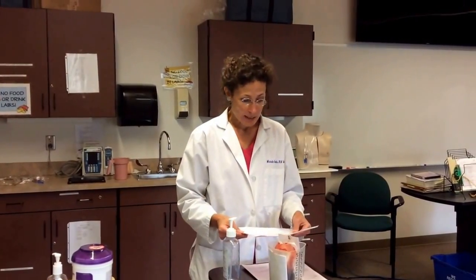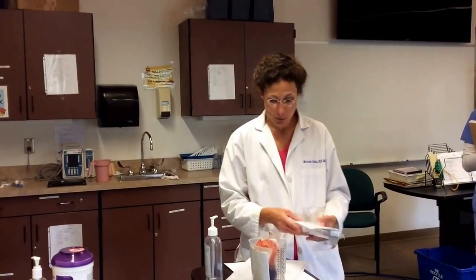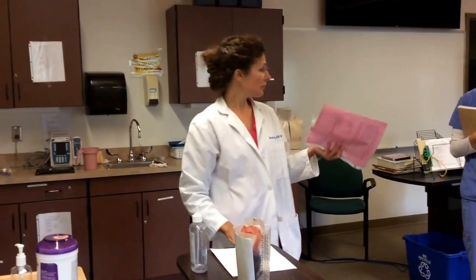Good. So the first thing we're going to do is go into the room, do some assessment with Mr. Smith, and see that he's ready to receive this blood transfusion. I'm going to take some supplies with me. I'm going to take some blood tubing, a flush, alcohol wipes, and a bag of saline, a 500 milliliter bag.